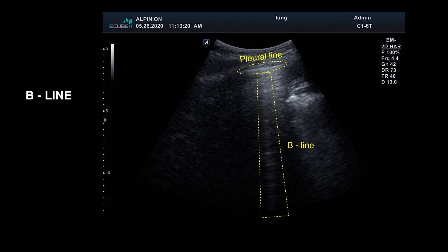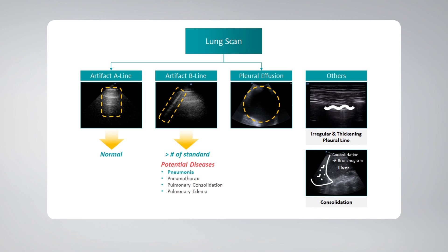As mentioned earlier, lung ultrasound findings in COVID-19 patients include a thickened, irregular pleural line, B-lines, and consolidations.